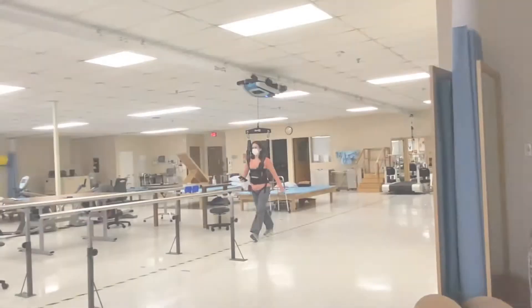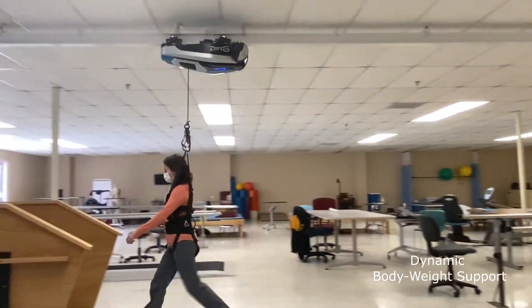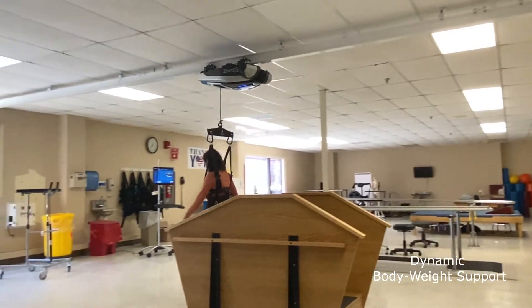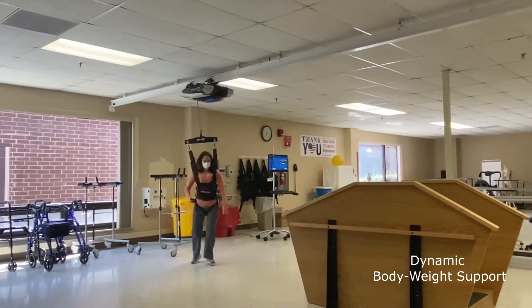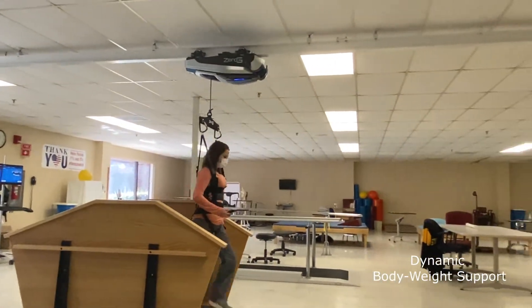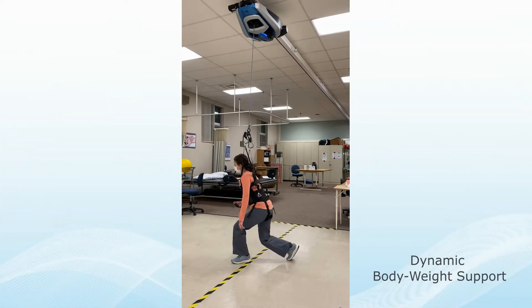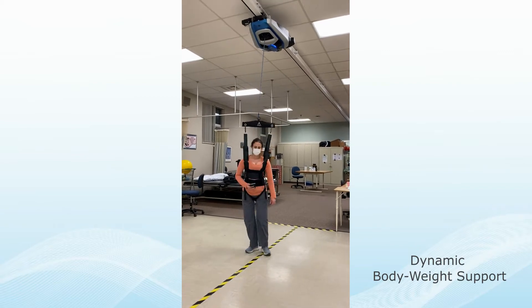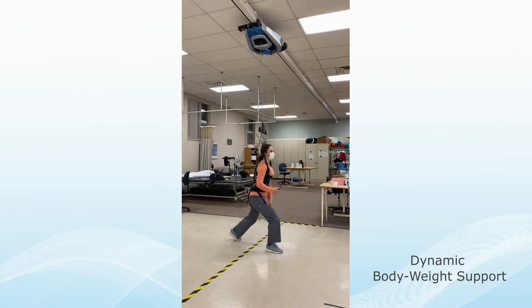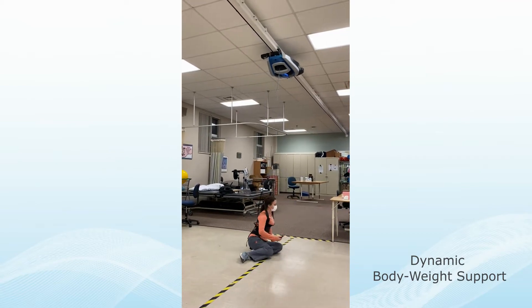The Zero-G Gait and Balance System is a robotic bodyweight support system. It provides dynamic bodyweight support, which provides constant unloading even during vertical movements, so the subject can move through a variety of activities in a reduced-gravity environment. The clinician has the ability to offload the subject's weight between 10 and 200 pounds with subjects who weigh up to 450 pounds.